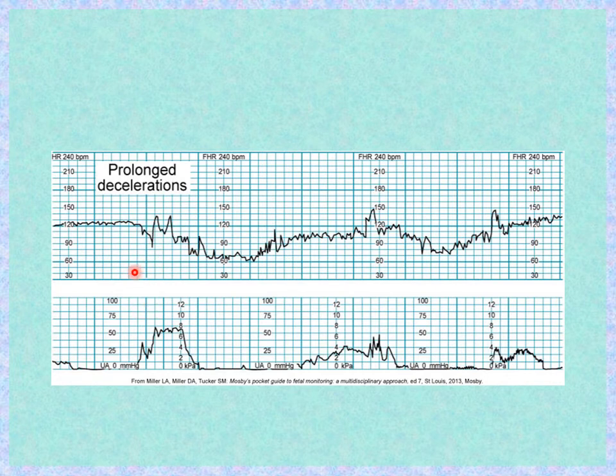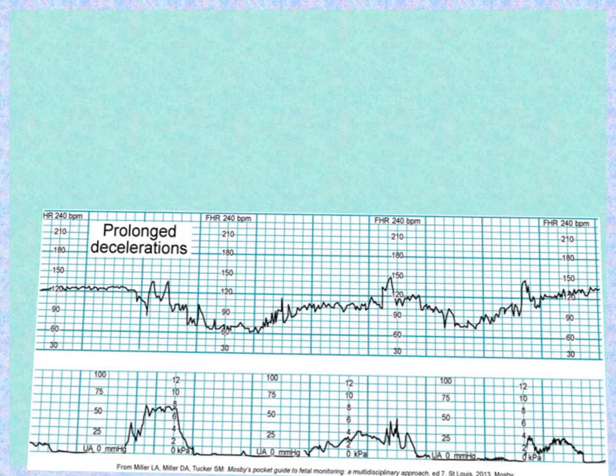You can definitely see that these are prolonged decelerations. The heart rate goes down here, and it's down for 1 minute, 2 minutes, 3 minutes, and finally begins to return to baseline right here at about 4 minutes. So this is definitely a prolonged deceleration.